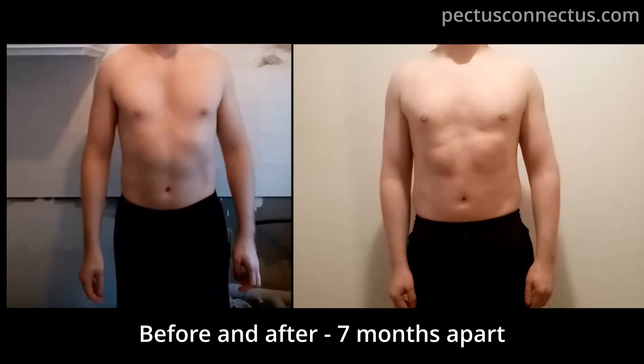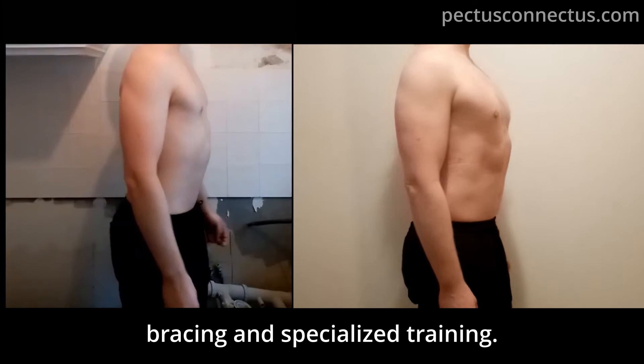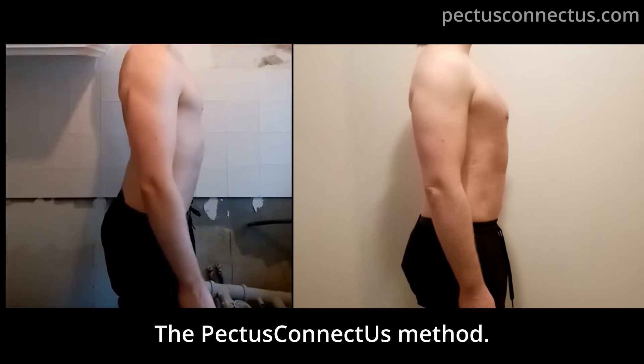Before and after, 7 months apart. Achieved by the vacuum bell together with bracing and specialized training — the Pectus Connect Us method.